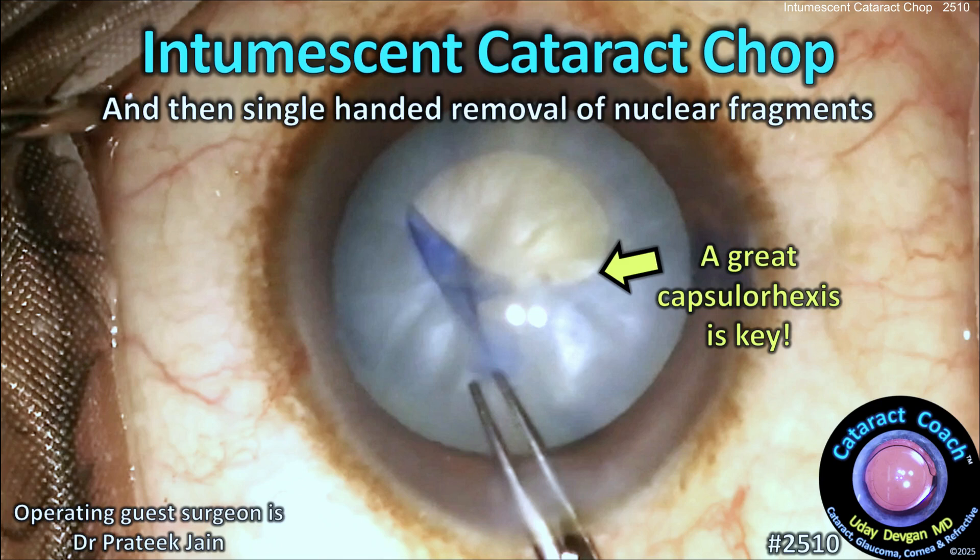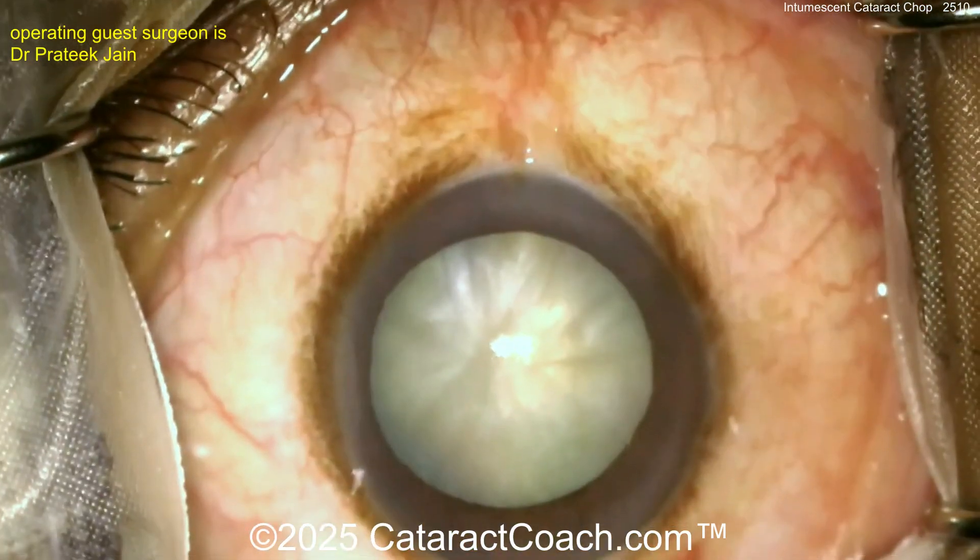CataractCoach.com presents the intumescent cataract chop technique and then single-handed removal of the nuclear fragments. Let's check it out together.